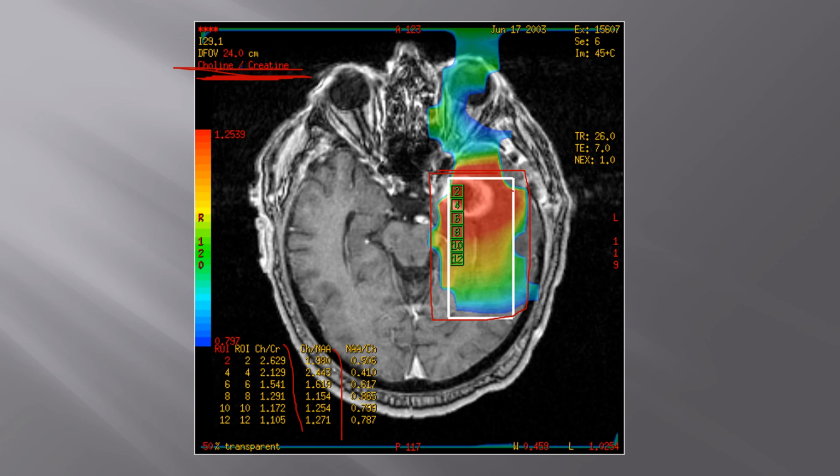And so you have this tumor signature, elevated choline/creatine in the lesion, and also outside. This is hanging out a fair amount above 1. When you get down near 1, that's going to be more normal. Maybe a little above 1 would be normal too. You can also get the choline/NAA ratio. Here we are above 2. And again, when you get down near 1, you're going to be in more of a normal area. So going from markedly abnormal to nearly normal with a metastatic lesion wouldn't have the extension outside of the area of enhancement. So you have this very tumoral signature in this location that argues for a primary tumor over a metastatic lesion.